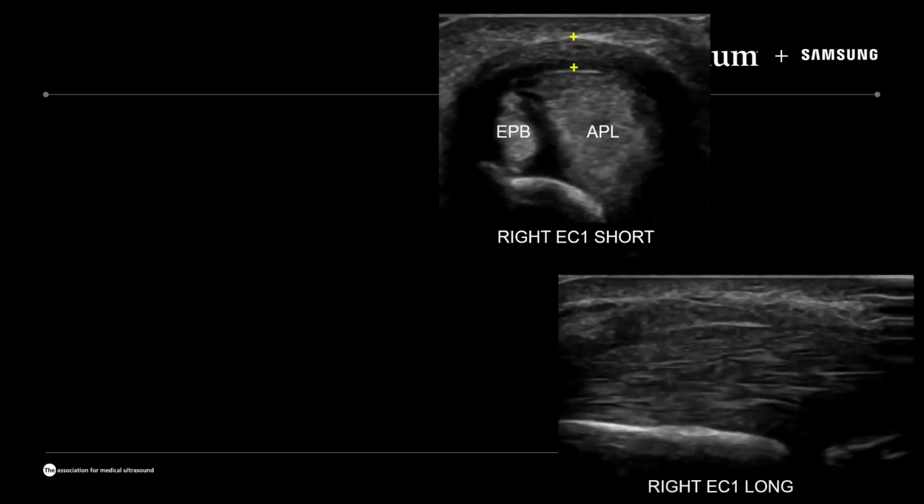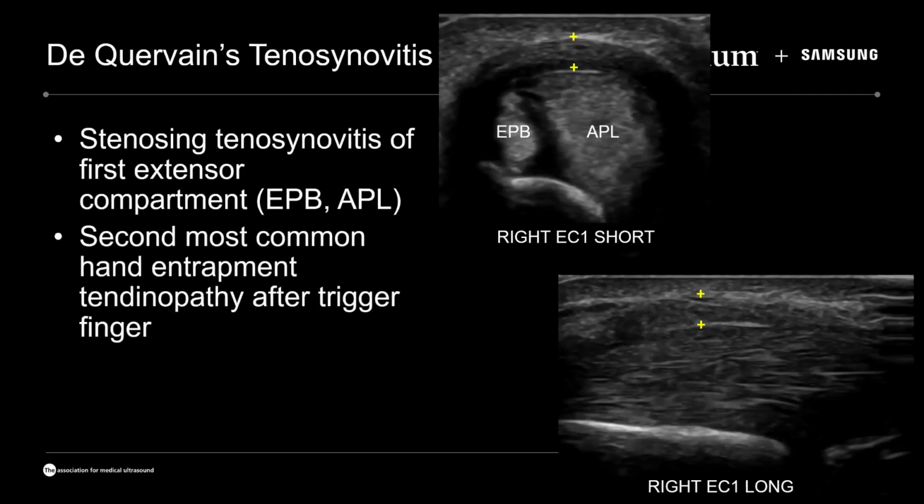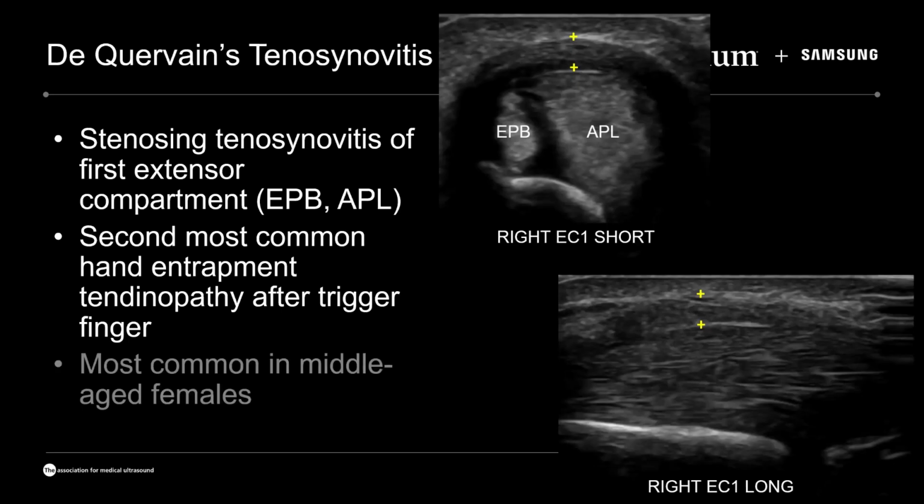And when we turn on long axis there, we can also see the thickened extensor retinaculum overlying the tendons there. And this is a typical example for de Quervain's tenosynovitis. So this is a stenosing tenosynovitis of this first extensor compartment. And it's actually the second most common hand entrapment tendinopathy after trigger finger, which occurs on the ventral side. We see this most commonly in middle-aged females. It can be idiopathic or due to repetitive motion. And it also has an increased incidence during pregnancy.